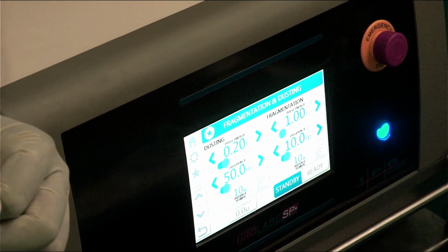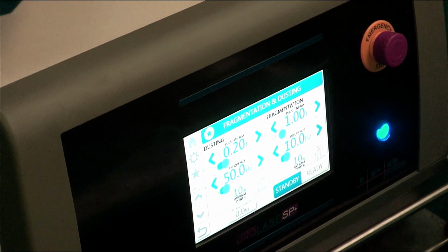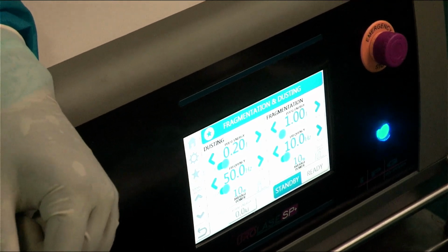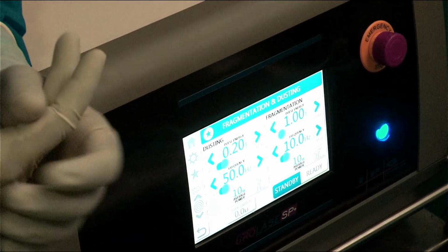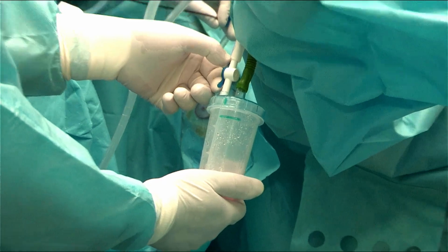Sir, the dusting part is very good with thulium. And you can use it in the kidney because the space is very big, so there is no question of injuring the renal parenchyma or anything else. But when using it in the ureter, you have to be very, very cautious because it causes more charring than the holmium.